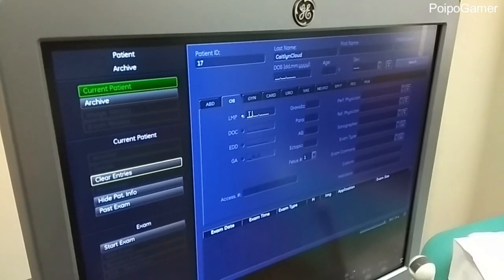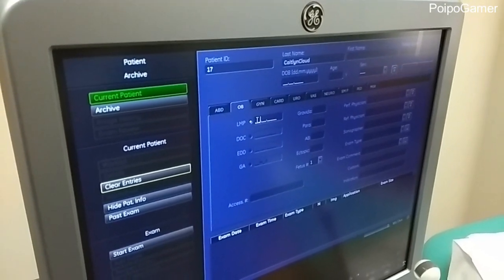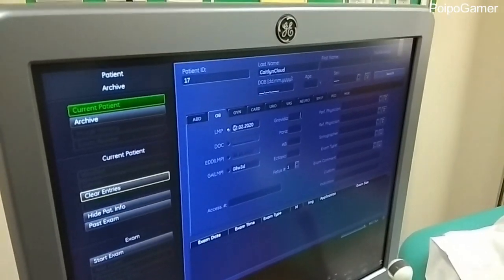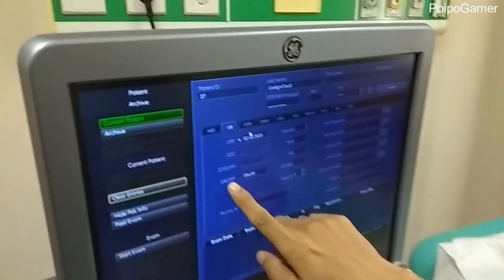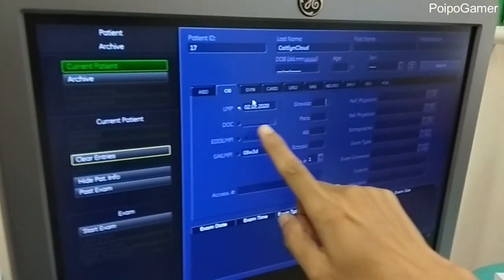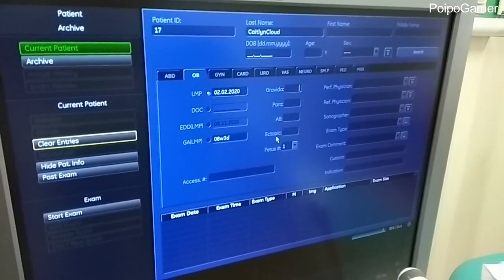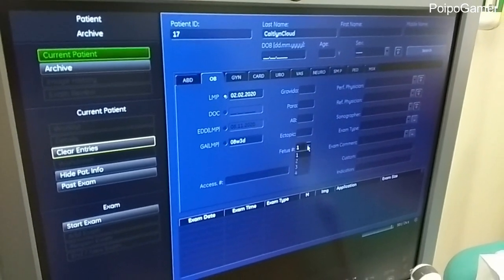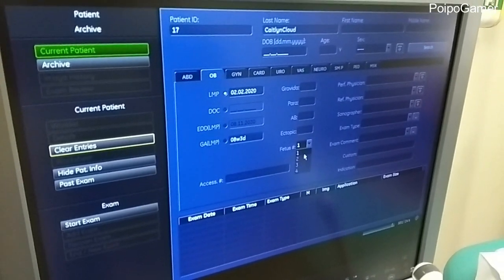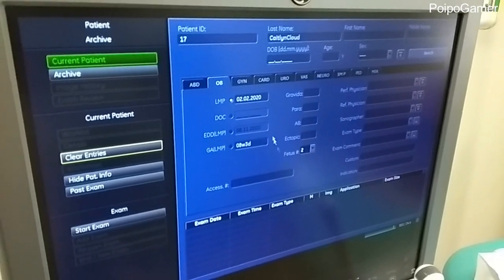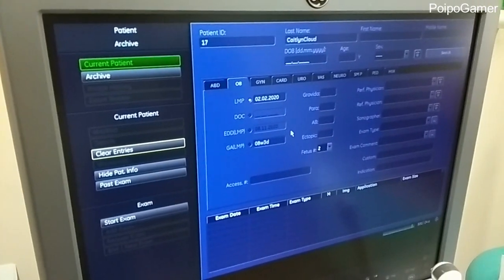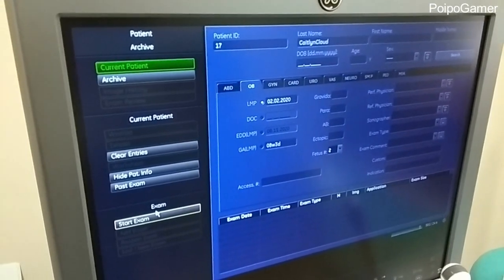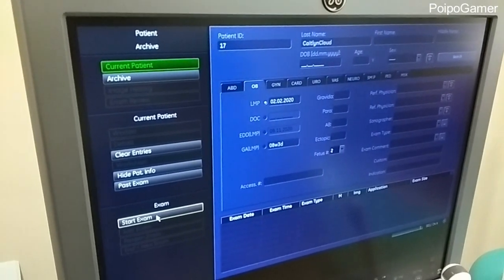And this is the LMP — Last Menstrual Period. And by inputting this, you're gonna automatically generate this. So, this is the fetus — how many fetus? Maybe just two. And that's it. We can start the exam here, just click this.